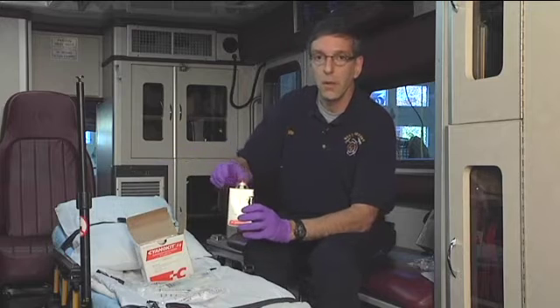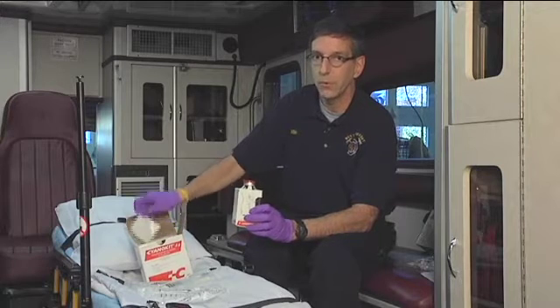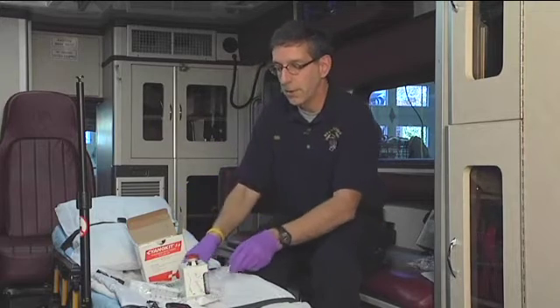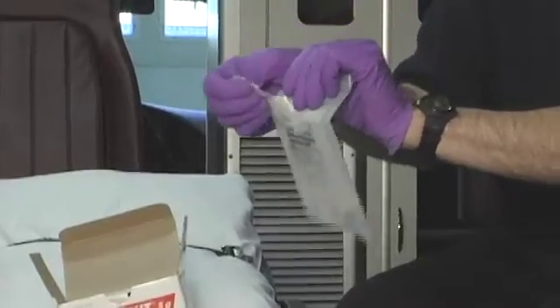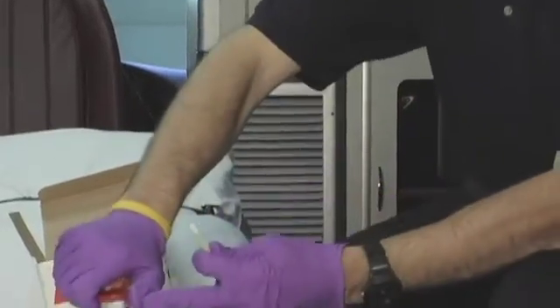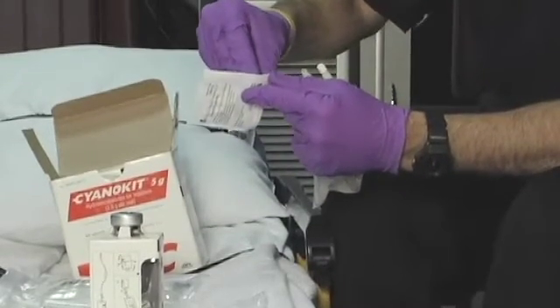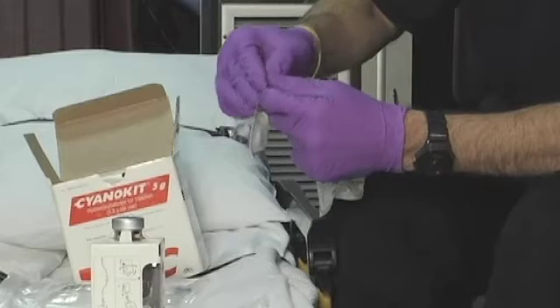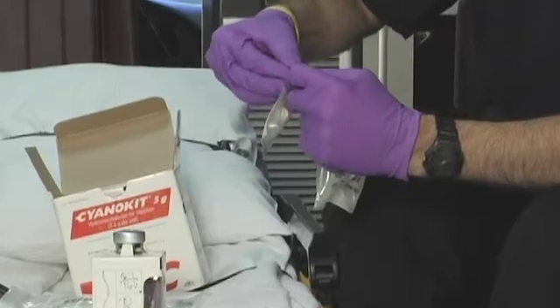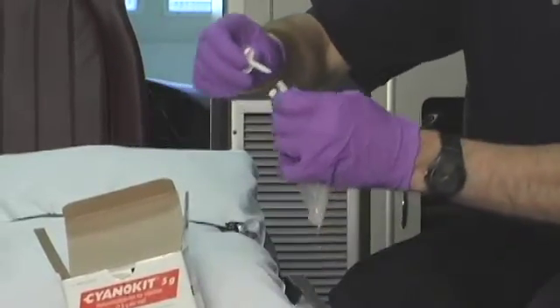The mixing is a little tricky for those not used to mixing medications in the field, which is most of us in EMS. The kit comes with a spike, and we're going to use the spike to connect the bag of diluent to the Cyanokit bottle. The spike is a medication mixing spike with a sharp end on both sides, allowing medication to flow from the bag into the bottle.